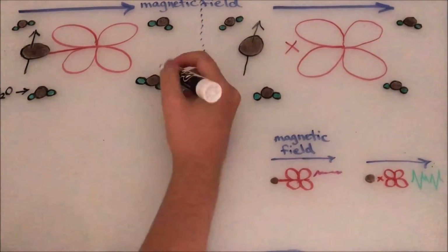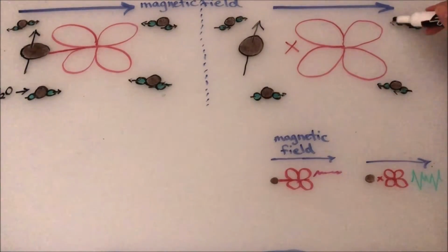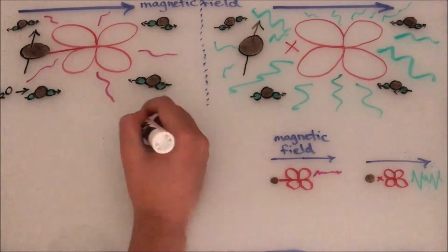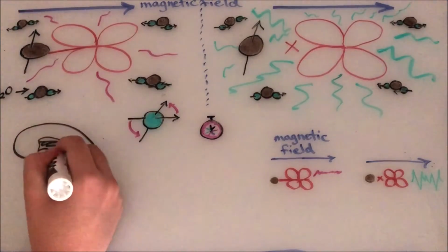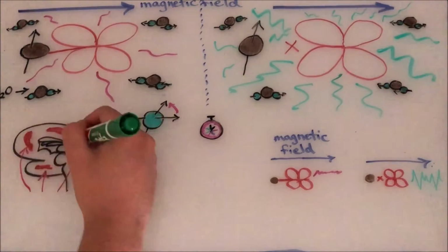So when oxyhemoglobin increases in the active parts of the brain, it takes away a bit of that disturbance, letting that signal from the hydrogen atoms be picked up sooner. So really and truly, the signal comes from the hydrogen in the water molecules, and fMRI distinguishes its spin realignment when more oxyhemoglobin is there, and its spin alignment when more deoxyhemoglobin is there.